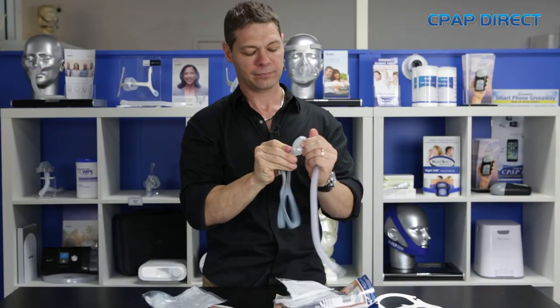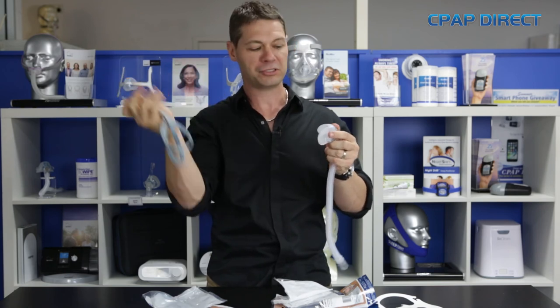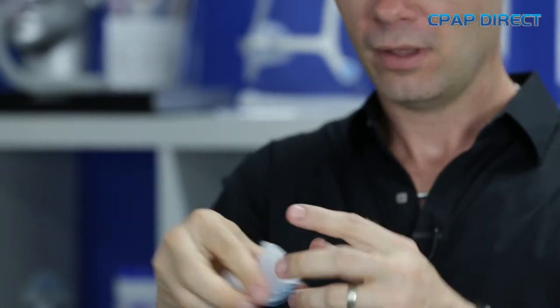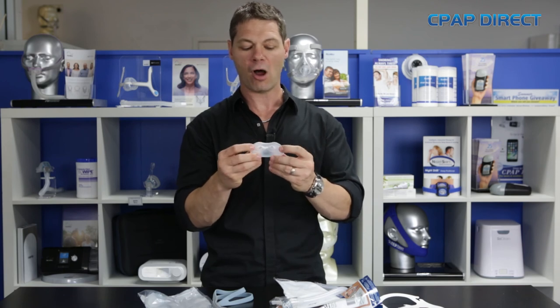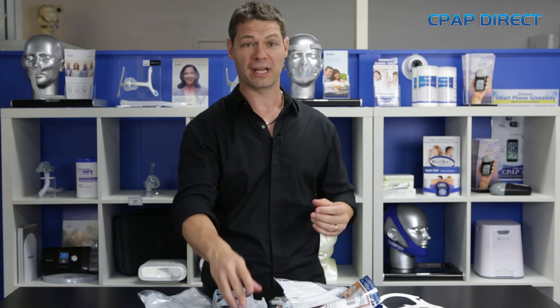When you want to wash it, you can just unclip the straps, leave the Velcro done the way it's supposed to, and throw them in the wash. When you clip off the pillows, you can just use a bit of warm soapy water to clean them out as well. All in all, fantastic design mask — very quiet, very comfortable — and now with two different sized pillows included. I can't think of another pillow mask on the market right now that is anywhere near as good as that.